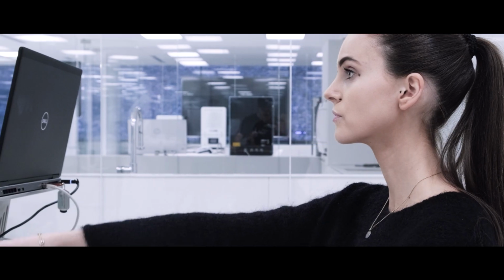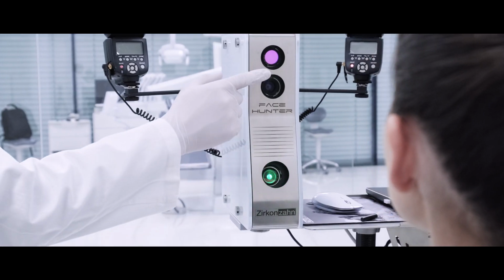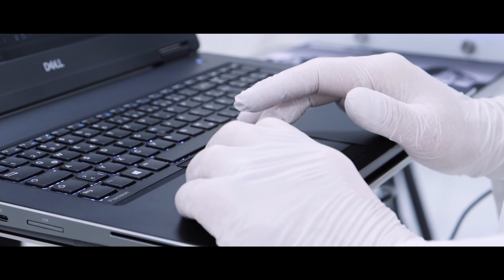The Face Hunter is properly distanced from the patient before starting with complete acquisition of the face in neutral expression. At this stage, a frontal scan, a 45-degree right lateral scan, and a 45-degree left lateral scan are performed.